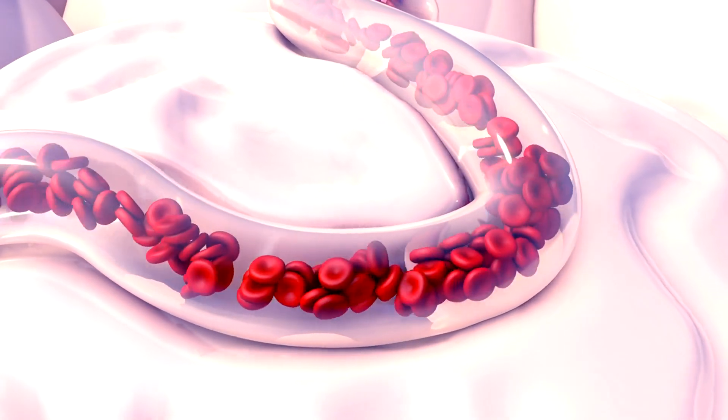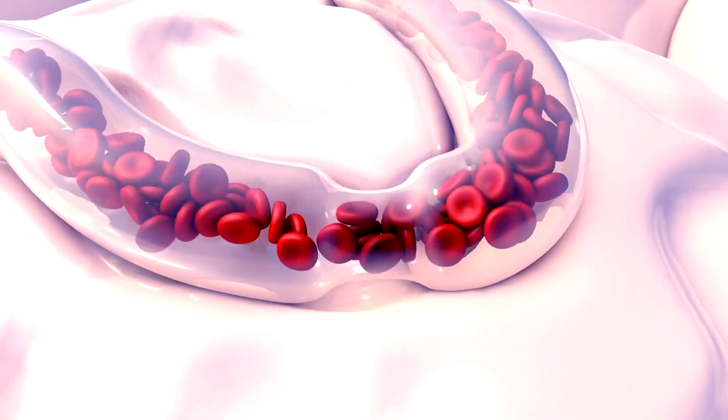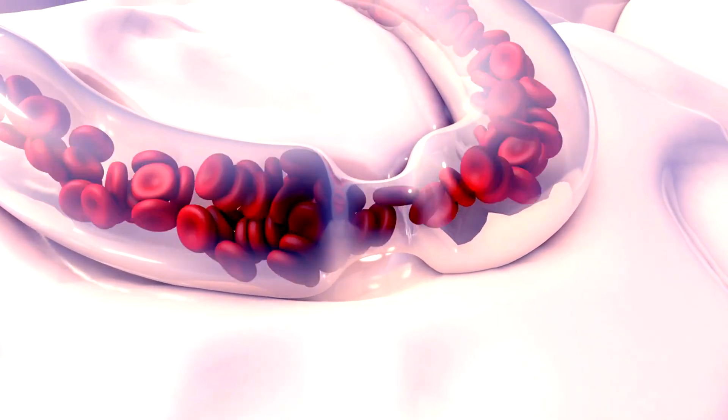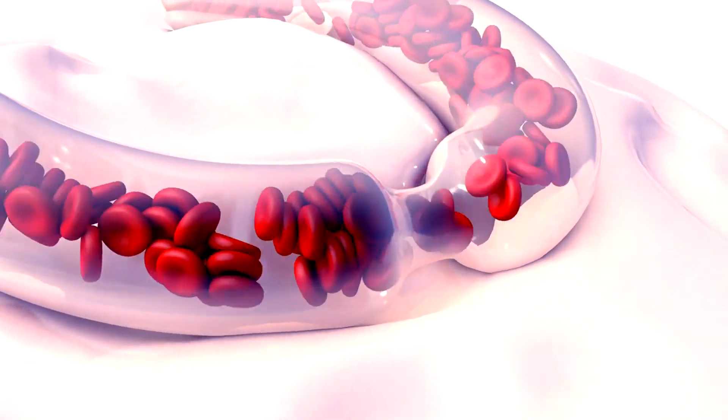If a blood clot is causing the blockage, medication may be delivered directly into the clot via catheter to dissolve it. This is called thrombolysis.